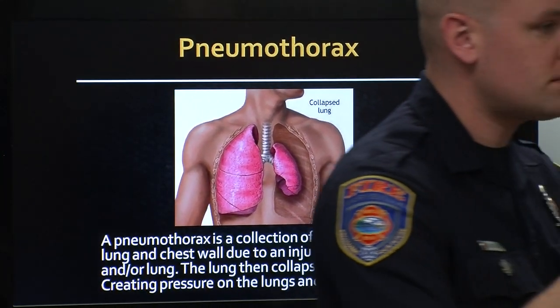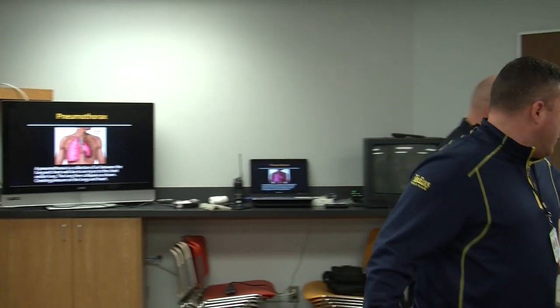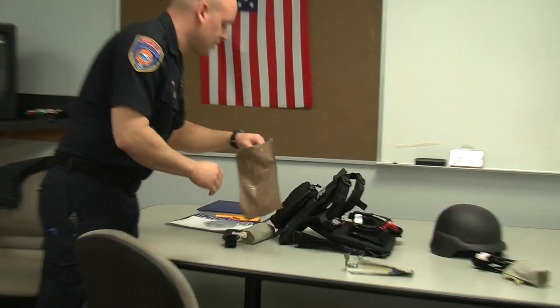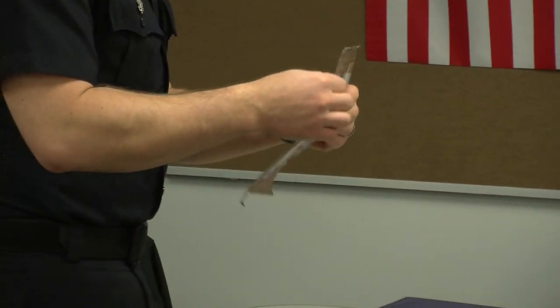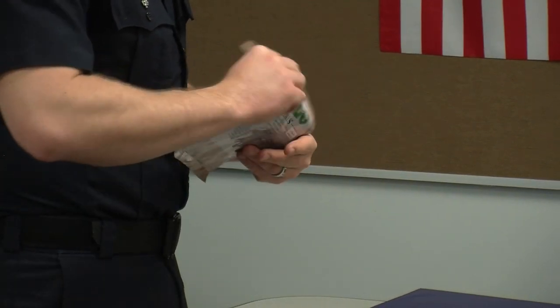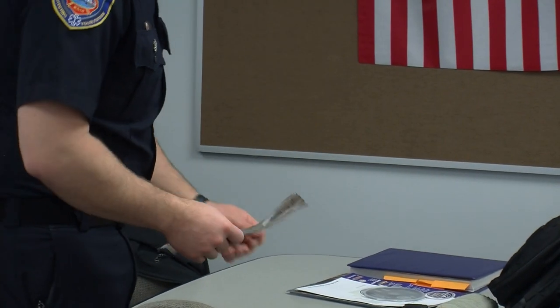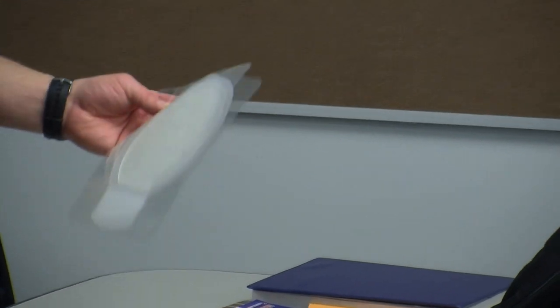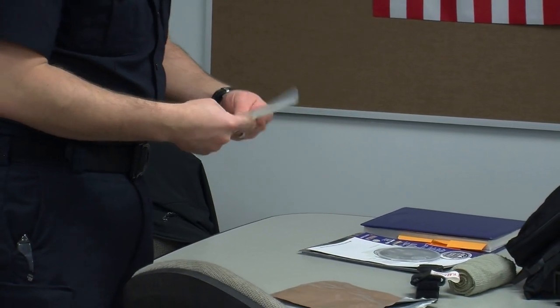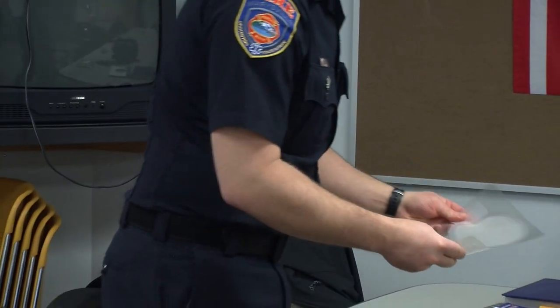The halo dressings, or the chest seals. Those are also in the kit. They're in the kit there. When they're inside the package, you can roll it, you can fold it, do whatever you want to it. I contacted the company, said, hey, the pouches we want to put these in are a lot smaller than this gigantic package. What can we do? They said, you're not going to degrade it at all if you want to fold it. But inside, there's two of them.